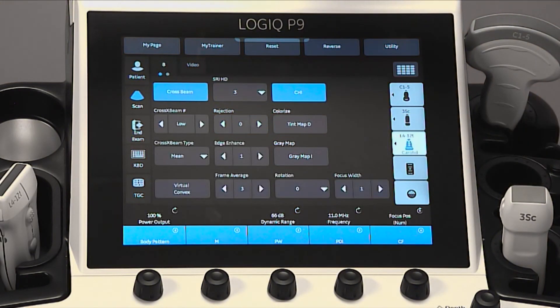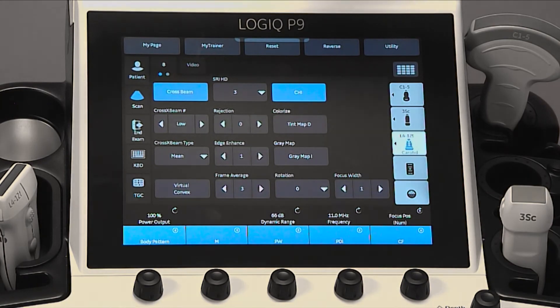Please refer to the Logic P9 quick card guide or user manual for additional parameter details.